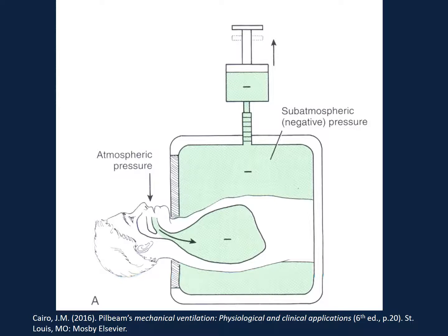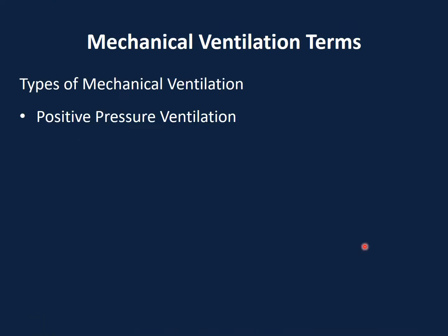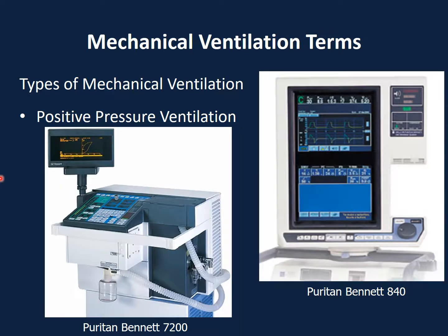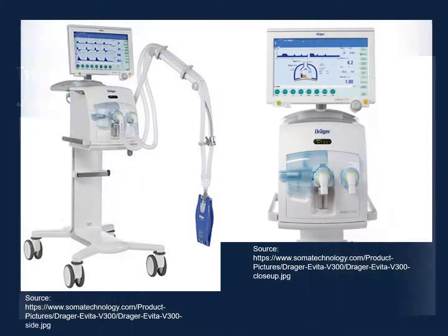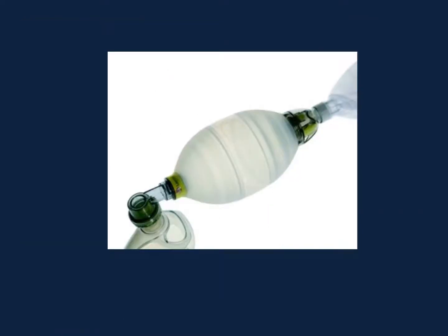Okay, it's not ideal. So in modern times, all mechanical ventilation is positive pressure ventilation, and these are some of the models and makes of mechanical ventilators that you might see out there in Singapore's ICU. Okay. More models, and this is the model that you have seen during the lab this week. Okay, and you'll have the chance to play around with it. Then let's consider the manual resuscitator bag, which you are quite familiar with, right?